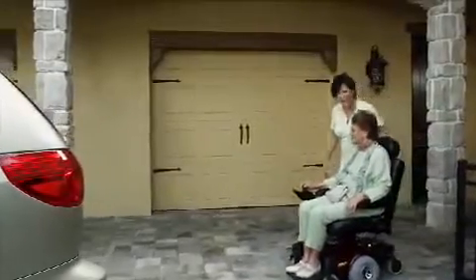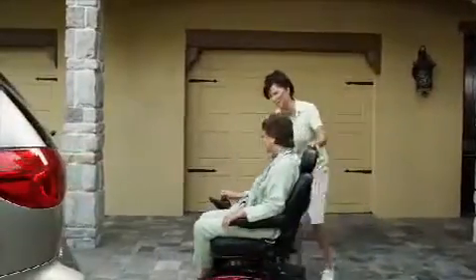Going out for lunch and a movie is a very important time together for mom and her daughter. And taking mom's power chair with them is an easy task with their Harmar Premium Inside Lift.